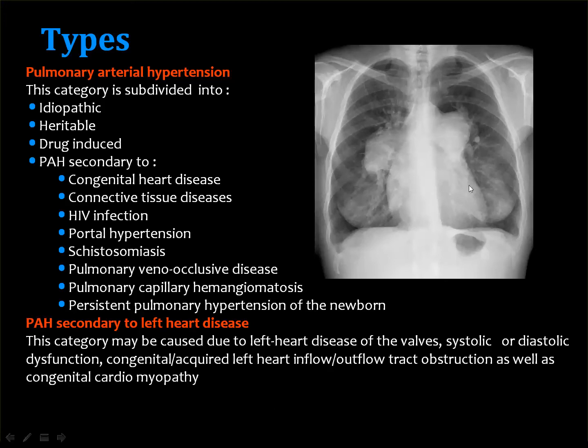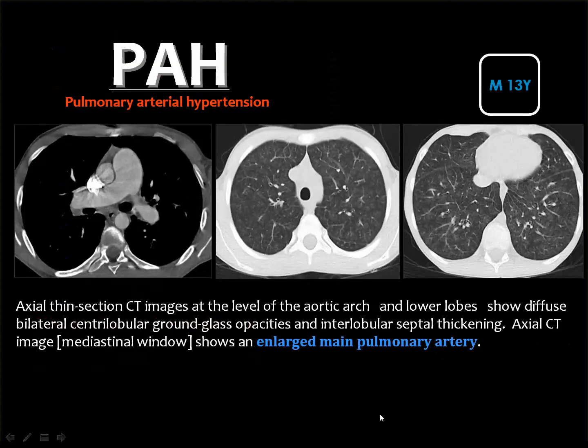And we used to diagnose pulmonary arterial hypertension from the chest X-ray by the presence of massive dilatation of the pulmonary trunk as well as its central branches, with a relative attenuation of the peripheral arterial circulation. Then this appearance will be reflected on the pulmonary parenchyma in the form of a heterogeneous appearance, which is well known in the literature as the mosaic appearance.